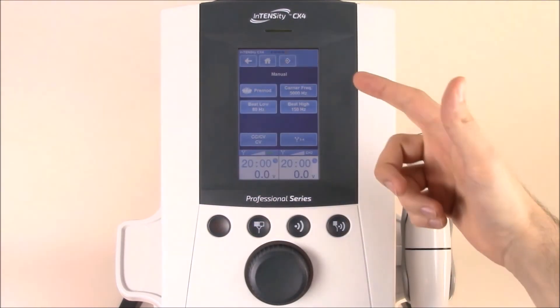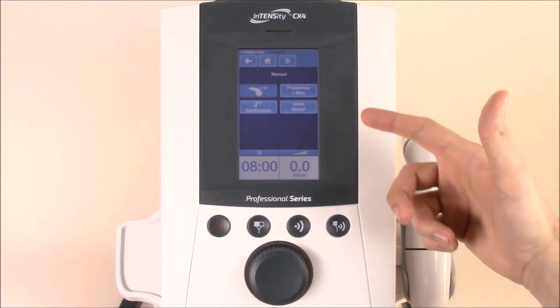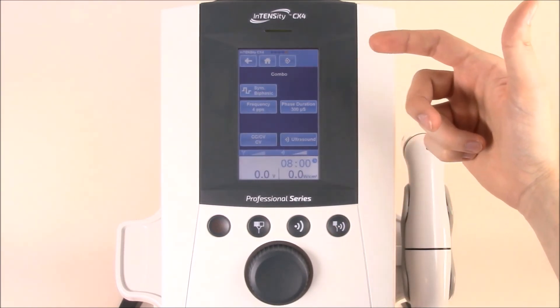This jumps you right into the electrotherapy screen, jumps you right into the ultrasound screen, and finally jumps you right into the combination screen.